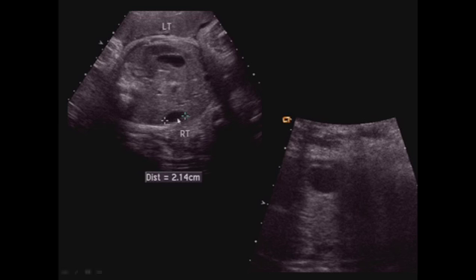In this patient, we can see on the right side, so we're looking at the liver, this anechoic structure right up against the rib cage. So when something's anechoic, we'd like to call it a cyst, but to call it a cyst, we need to have through transmission. So what do we do? We turned the mom on her side to try and get a shot at this 2-centimeter thing, coming from this side so we could get the through transmission. And here's the image coming in from the right side. You get this anechoic structure and you have the beautiful through transmission that let us diagnose a hepatic cyst in utero.